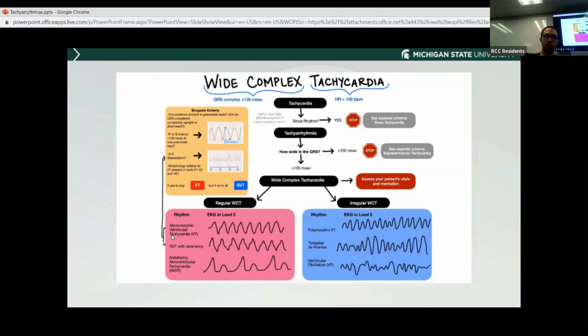I don't know if you heard, Abdullah, but what we're saying is that when it goes through the Purkinje fibers, that's why it's a fast conduction, and that's why you have the narrow complex. But what happens in ventricular tachycardias, or in any tachycardia with a wide complex, is that it fires through the ventricle muscle itself, and then it's slower than the Purkinje fibers. So that's why you have the QRS wide and above 120 milliseconds. That's what we are mentioning.